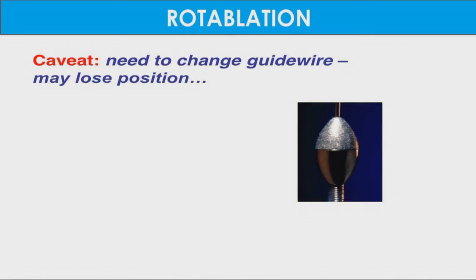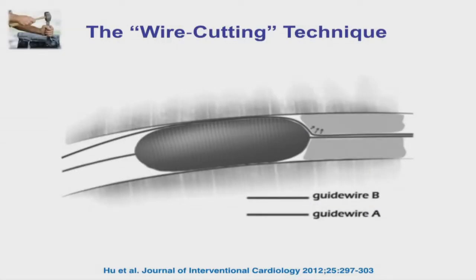Only if the microcatheter is crossing, you can do a rotablation. If the microcatheter is not crossing, you can even keep it where it goes and then try to exchange, where you might be successful, but if you lose the wire, then it fails.